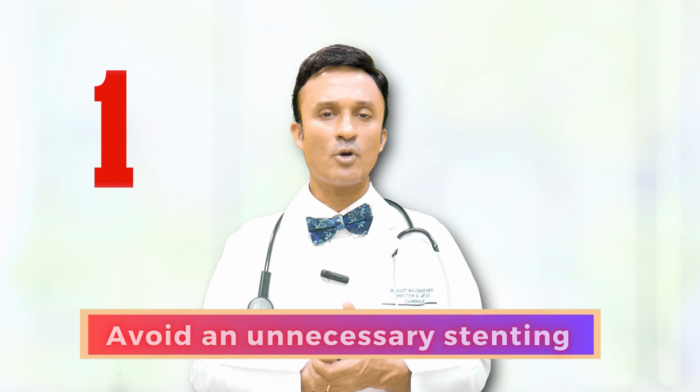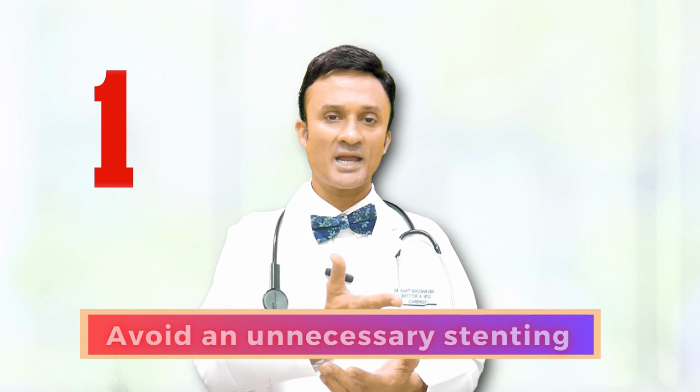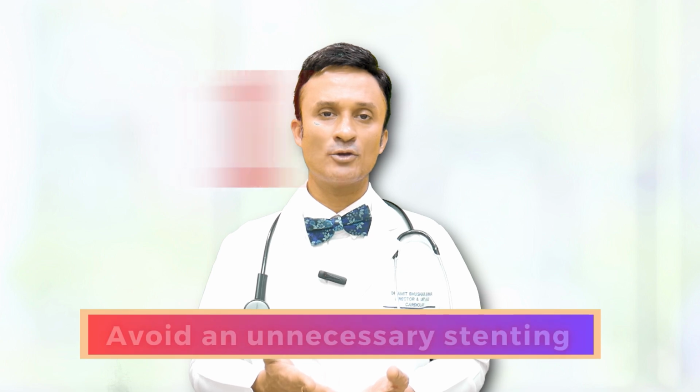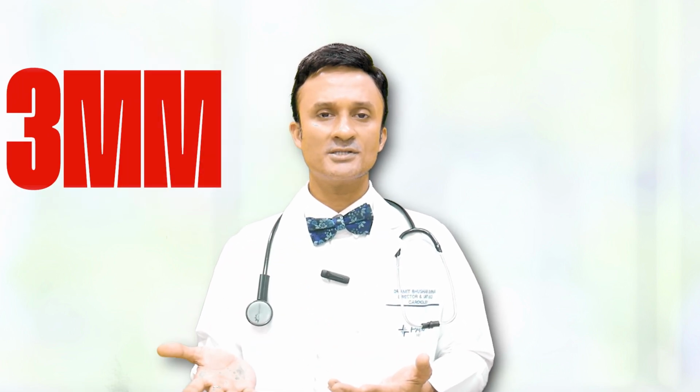If it is a borderline blockage of 60-70%, you will get to know whether we require any additional stenting or not. If FFR is less than 0.8, you require a stent. More than 0.8, you do not require a stent. Same way, if IVUS area is more than 3 millimeters, you do not require a stent. IVUS area less than 3 millimeters, you require a stent. Obviously, the technicalities vary from vessel to vessel, but this is the major jargon you should remember.